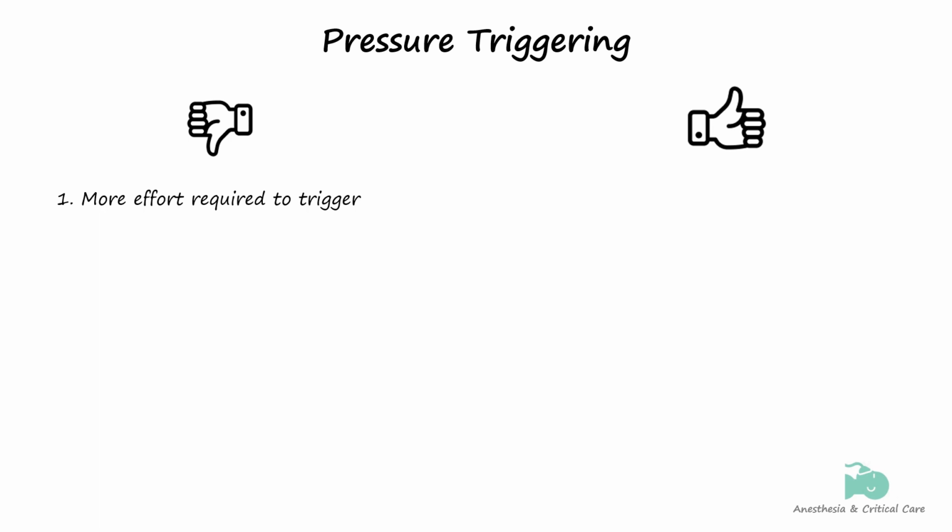There is a wasted respiratory effort, as no inspiratory flow is generated while the patient is inhaling against a closed inspiratory valve. If you remember, the breath is only generated when the pressure threshold is reached. This wasted effort may be counterproductive when the main objective of mechanical ventilation is to reduce the work of breathing. Despite these drawbacks, there are some scenarios which make pressure triggering useful.